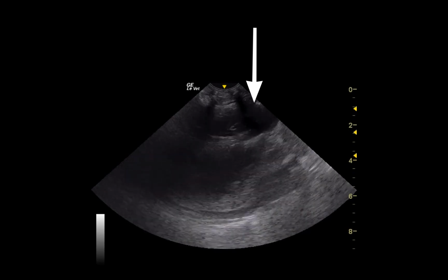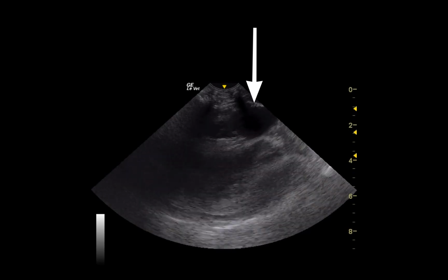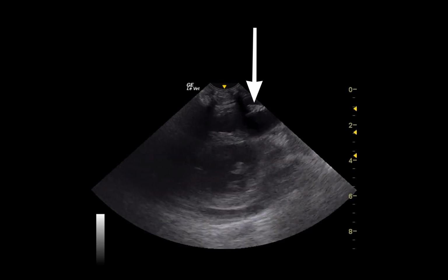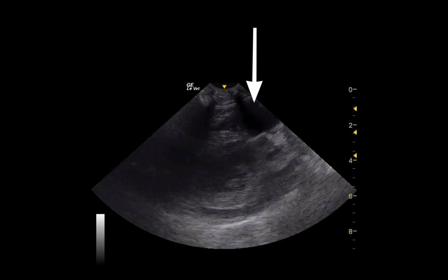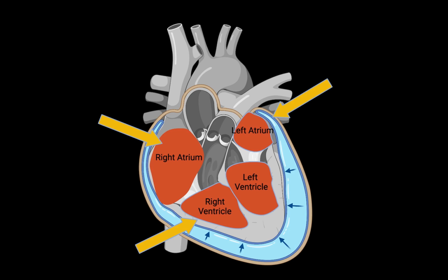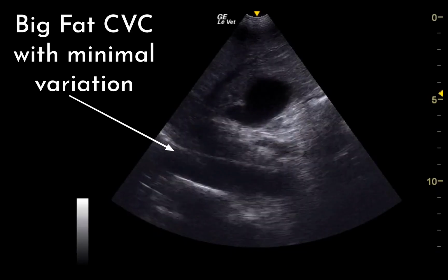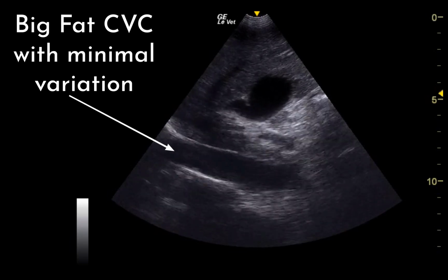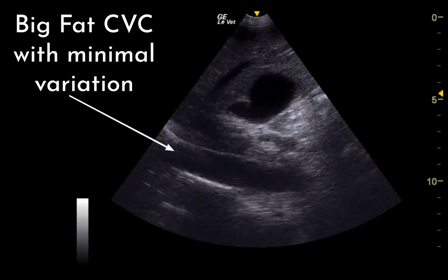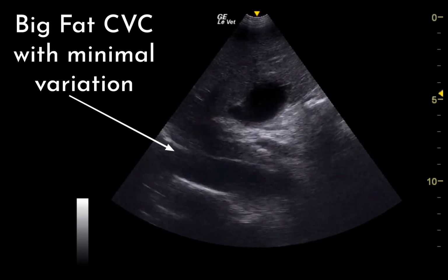Echocardiographic signs of cardiac tamponade may include diastolic collapse or serpentine deflection of the right atrial wall during diastole when the tricuspid valve is open. As the pericardial pressure continues to rise, the right atrial, left atrial, and right ventricular walls may get collapsed as well. It is common to find a dilated, non-compliant caudal vena cava in patients with cardiac tamponade due to the presence of very high right atrial pressure.